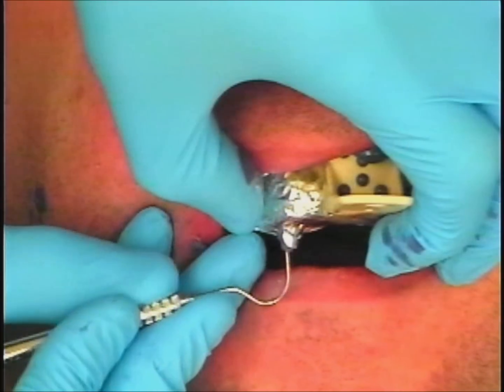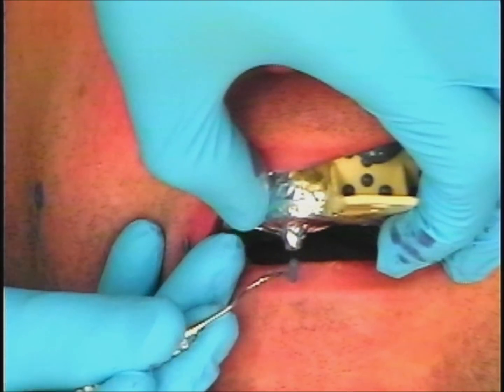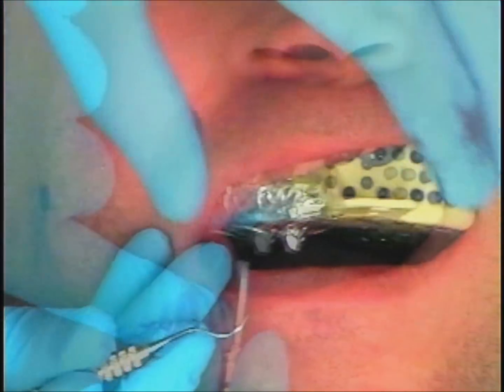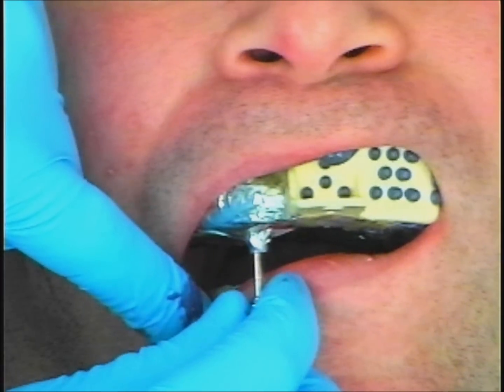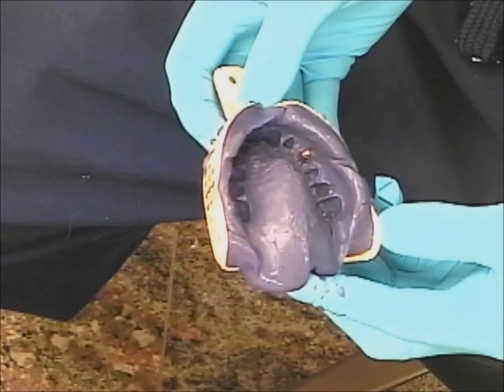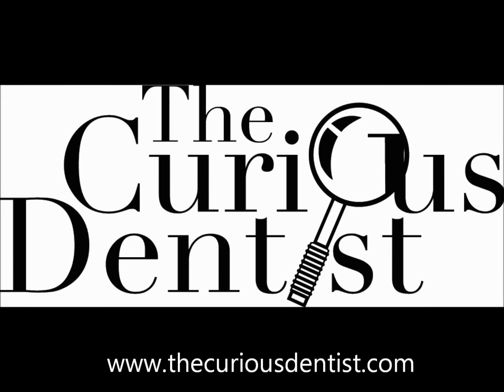Now that's going to stay in for a few minutes until it fully sets. Once it's fully set, I can just break that plastic tube off, or as you see here, I can pull the plug of impression material out from inside and then unscrew the tray that way, which is my preferred method. And once I have that unscrewed, I can pop out the impression. As you see, my impression coping has been retained. So that's the open tray technique.